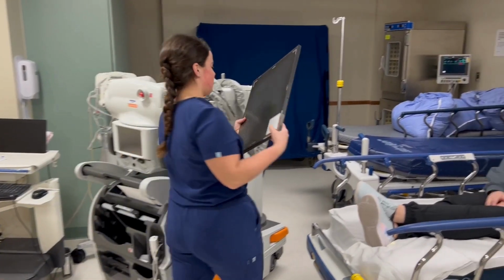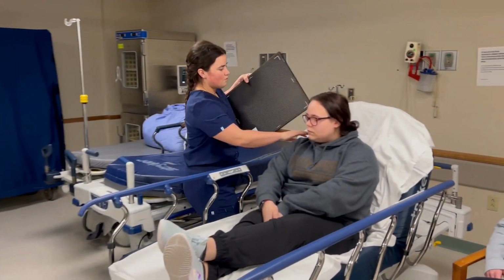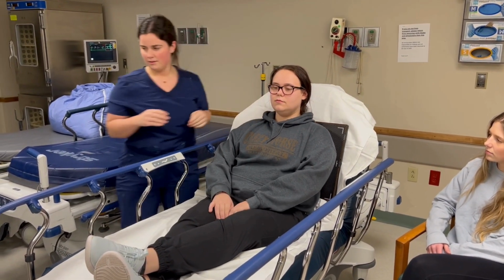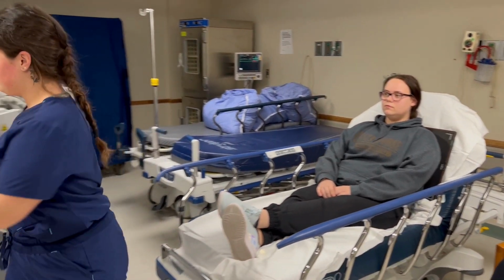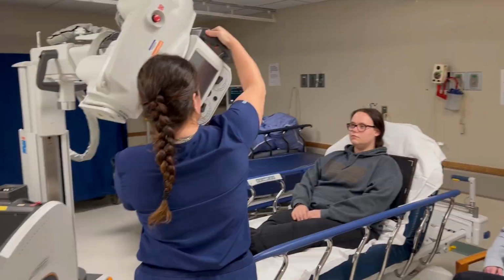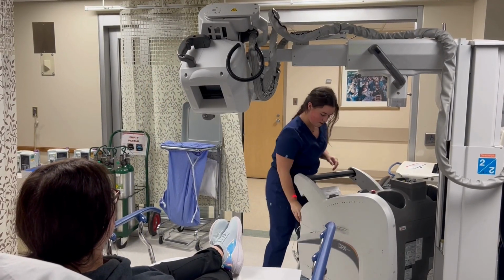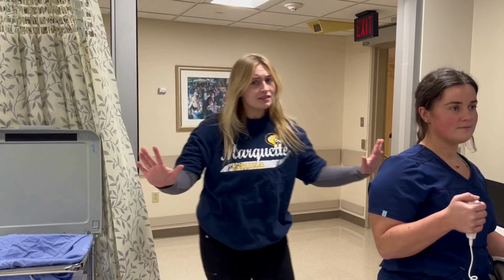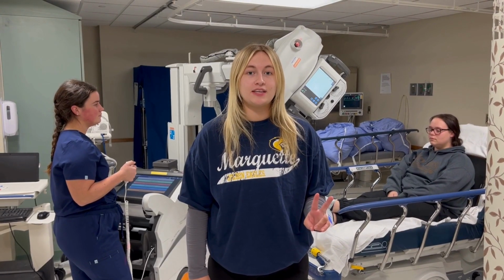Alright, so I'm just gonna get this behind your back. Have you lean forward for me. Alright, you can lean back. Good. Alright. Right now I'm gonna have you take a big breath in and hold it. Freeze! There are two things the technologist did wrong here.